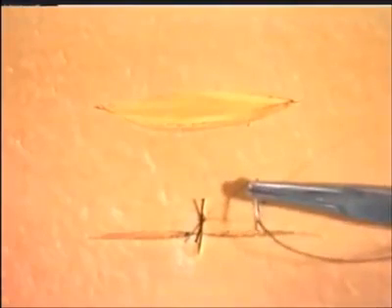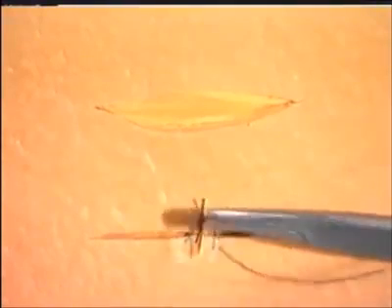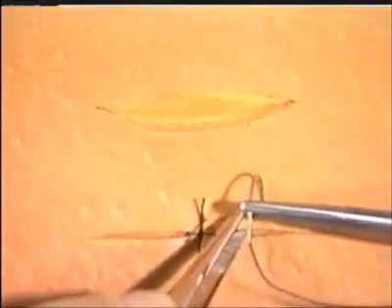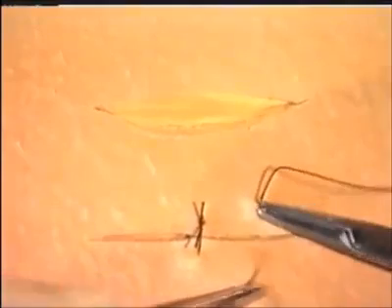Once the initial suture has been placed, it is then easy to halve the remainder of the incision, each side, to continue to close it. Therefore, insert one suture halfway along the remainder of one end of the incision, and ligate this.